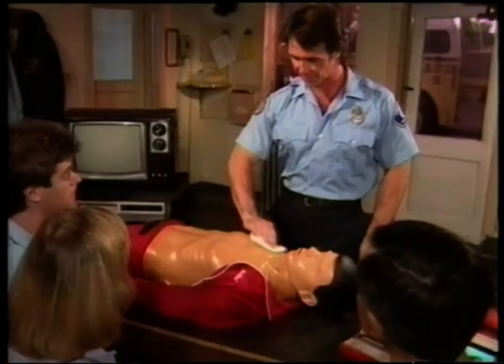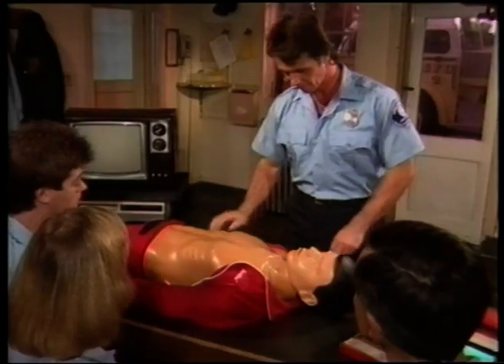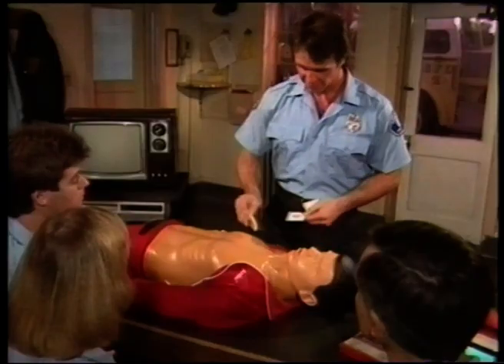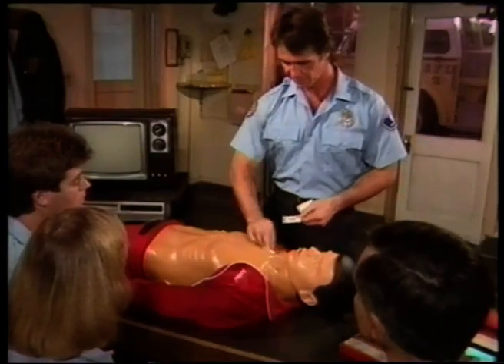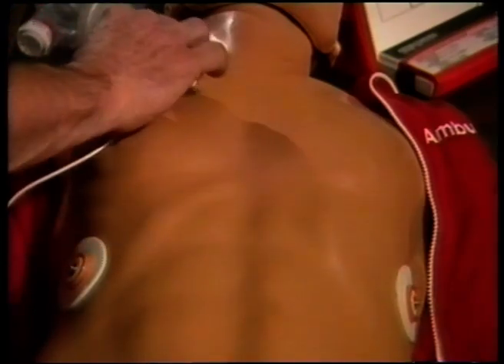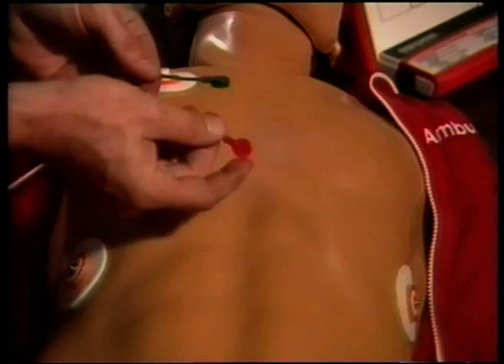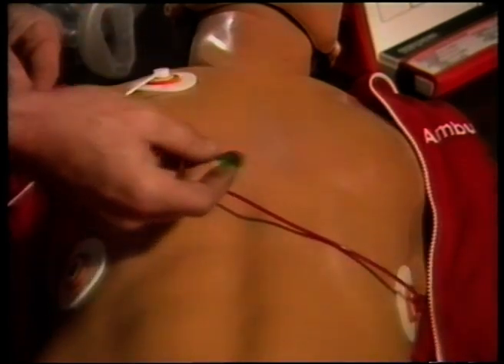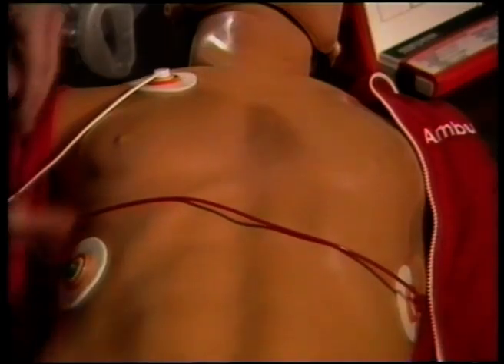As with the defibrillation electrodes, prepare the patient's skin by wiping off the chest prior to electrode placement. If necessary, shave or clip chest hair. Attach the cable wires to the electrodes as shown. Attach the white connector to the patient's upper right torso, the red connector on the patient's lower left, and the green connector on the patient's lower right.